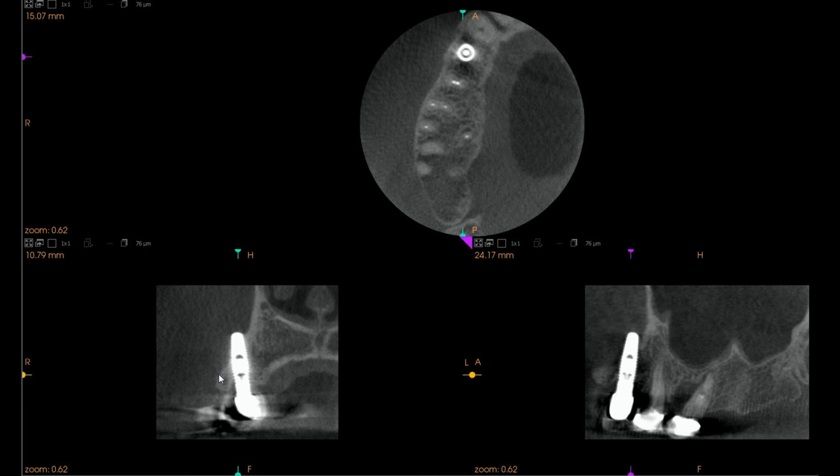She couldn't remember exactly when or who placed the implant, but this is a great example of why you need to have the right understanding and skill of implant placement to avoid this kind of thing from happening. I've placed many successful implants, and it's very surprising when you see something like this, because it should have been very clear to the dentist that something wasn't right when the implant was placed. So this is an interesting case, and I'll take good care of her to make sure she has a healthy, functional smile.